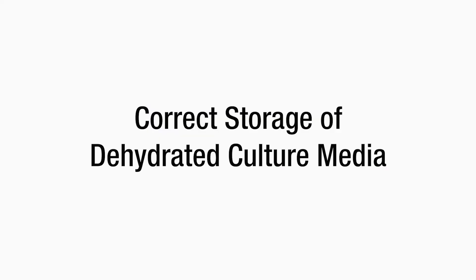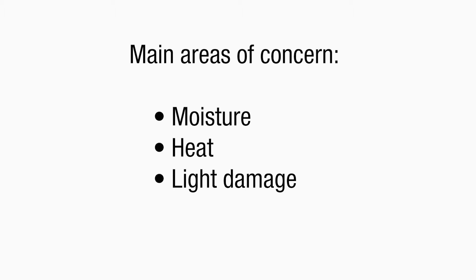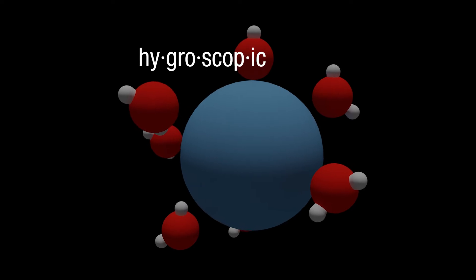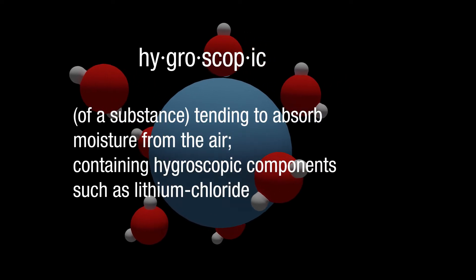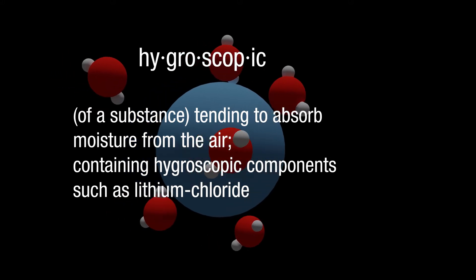Correct storage of the powder is essential to maintain the efficacy of the product. The main areas of concern for dehydrated culture media are moisture, heat and light damage. Many DCM products are hygroscopic, which are substances that have the tendency to absorb moisture from the air or contain hygroscopic components, such as lithium chloride.